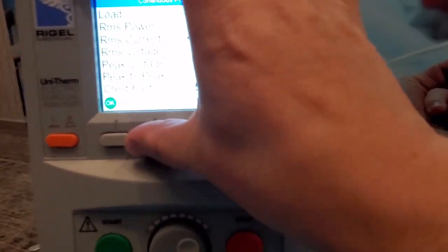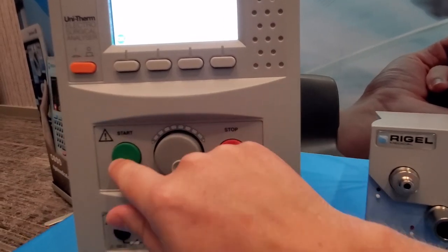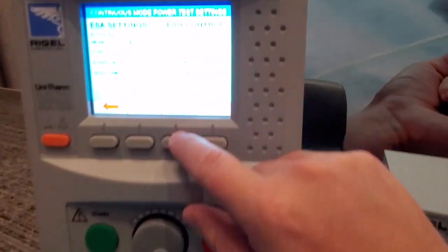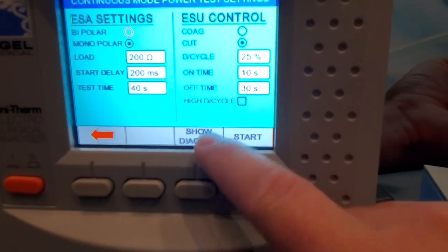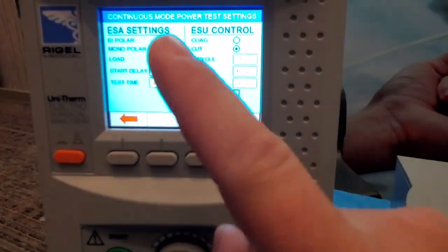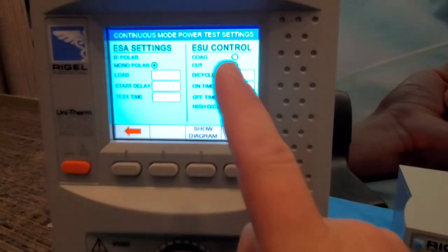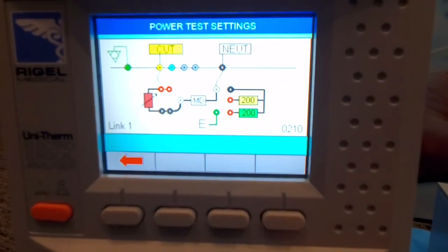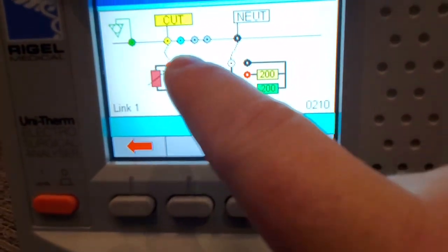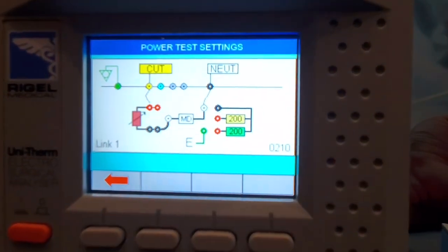This is a really cool feature — like the DayTrend, it has a diagram that shows you what to do. Notice the big color display. They have physical buttons instead of touchscreen, which is okay, but they have a 'show diagram' feature. It's got a pretty good description — you've got your neutral, your cut, you know what pins to connect to, and they're color-coordinated, so you know exactly what to connect to what.